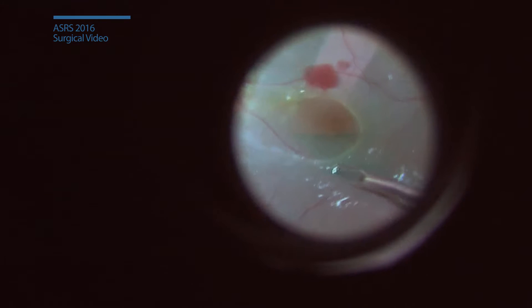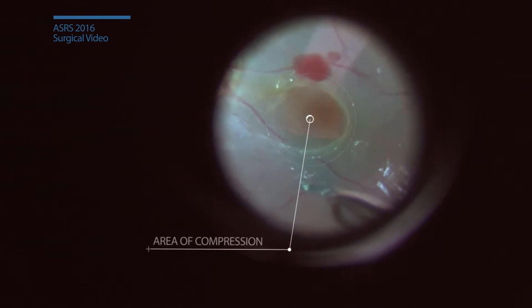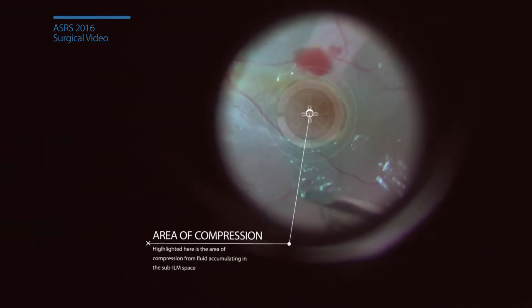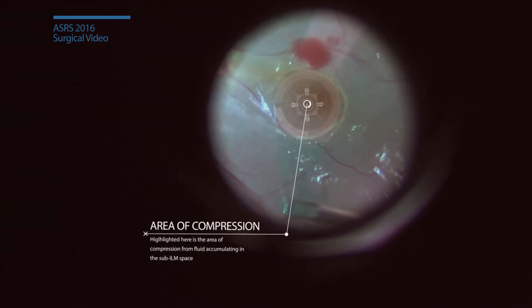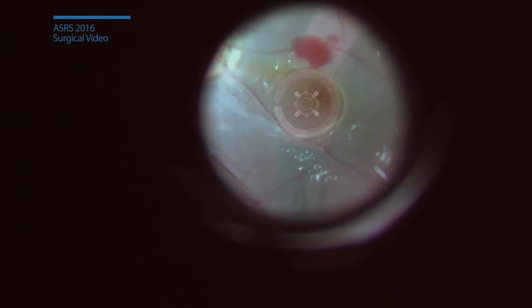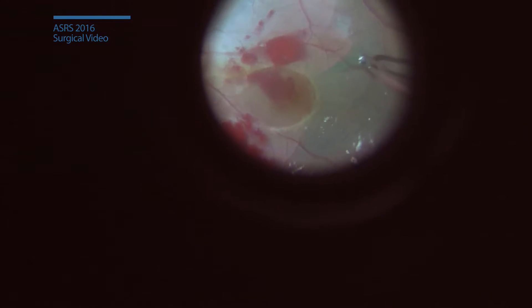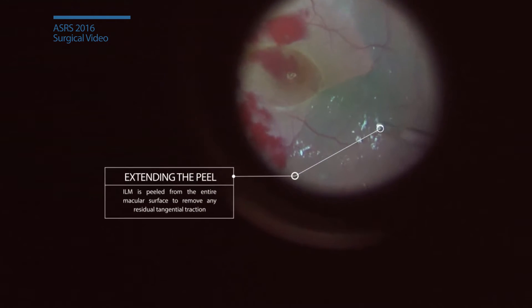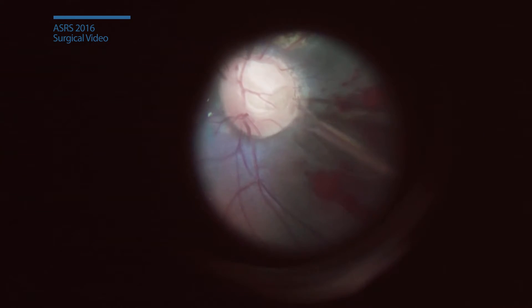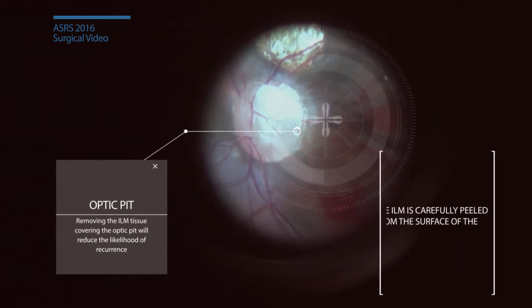The ILM is peeled from the macular surface. A small gush of fluid is witnessed when breaching the sub-ILM accumulation. The ILM is peeled from the entire macular surface. In order to fully decompress the central macula, the optic pit is carefully unroofed from the overlying ILM.